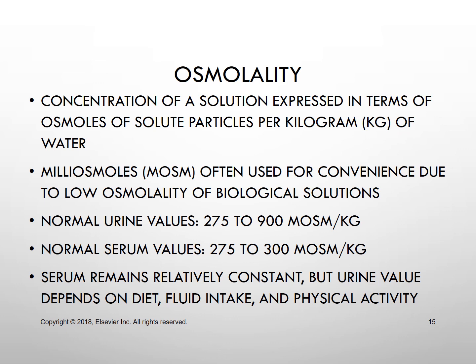A reason for doing osmolality measurements is to evaluate the renal concentrating ability of the kidneys, to monitor any kind of renal disease, to monitor fluid and electrolyte balance, and also to diagnose the causes of frequent urination.